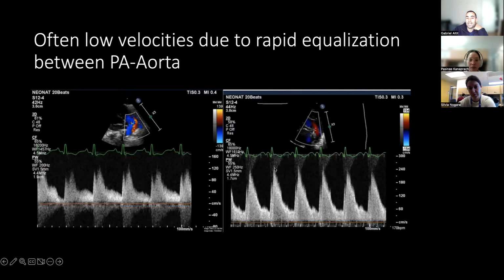And in the sense, you don't get this drop to zero, because this drop to zero tells me that each time there's a gush, it's like blue, blue, blue. There's no blockage of flow. The velocity of it is very small. So that's why they get these pulsatile kind of flow. So imagine like a heart that's pumping and you have an aorta and it's just pumping into the void, right? You get this pulsatile kind of spurt of blood. It's the same, but you're connected to the pulmonary artery instead of being connected to the environment.